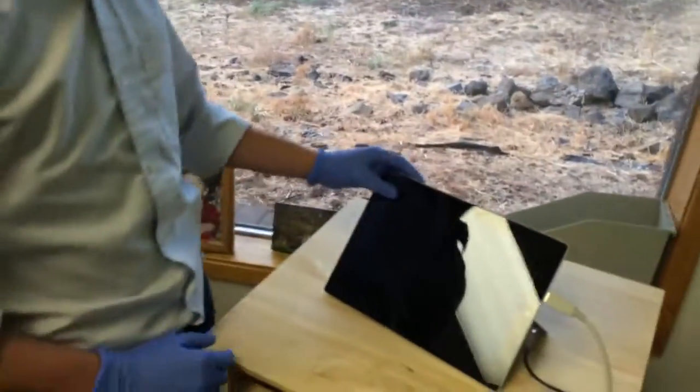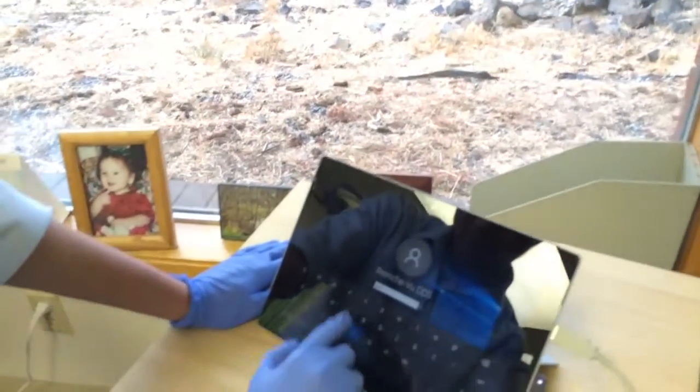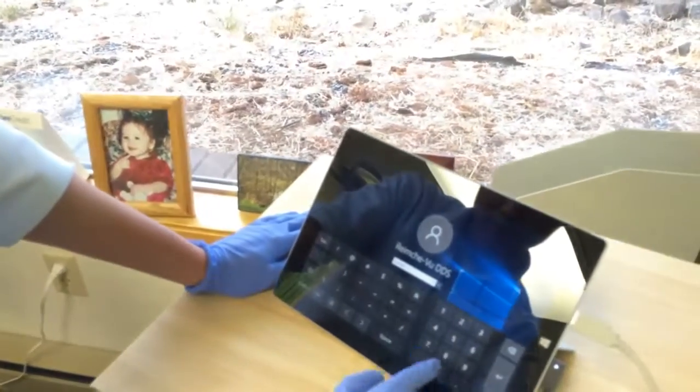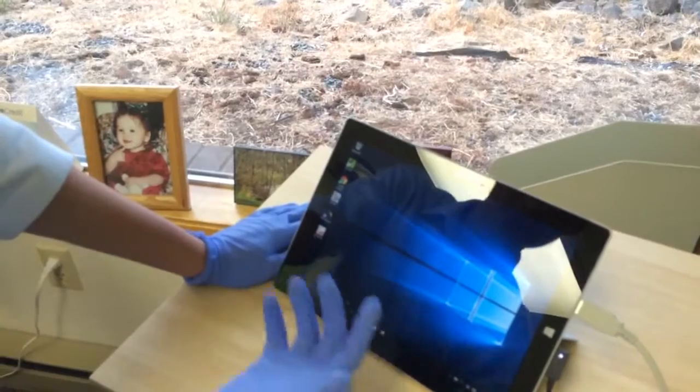That way, if we get a bad image, we want to be able to delete it. Just before you close to get out of that patient, just delete the ones that you don't like.